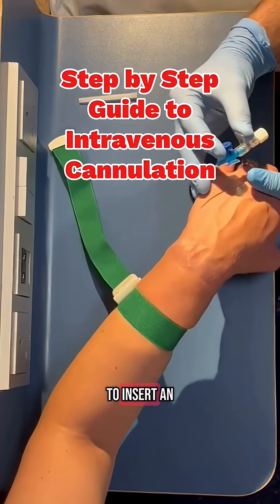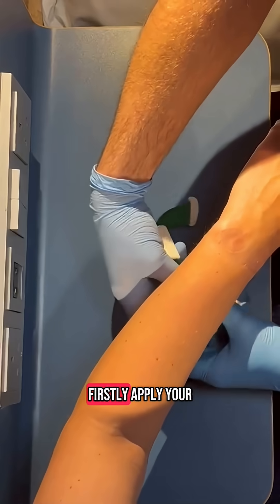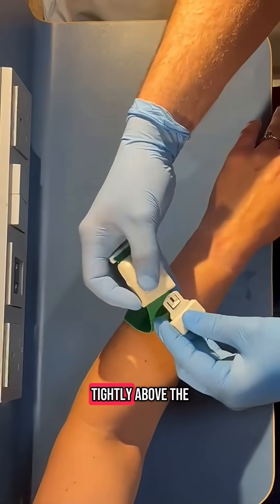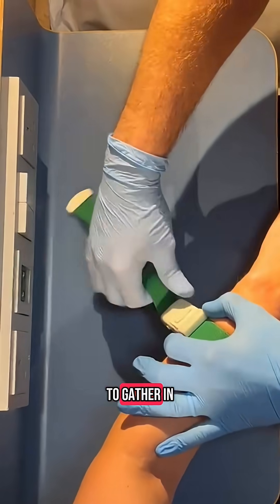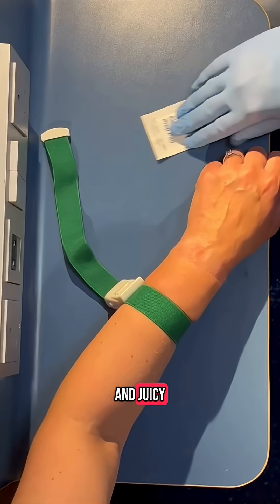Here's a step-by-step guide to insert an intravenous cannula. Firstly, apply your tourniquet tightly above the point at which you want to insert your cannula. This allows blood to gather in the vein and makes it large and juicy.